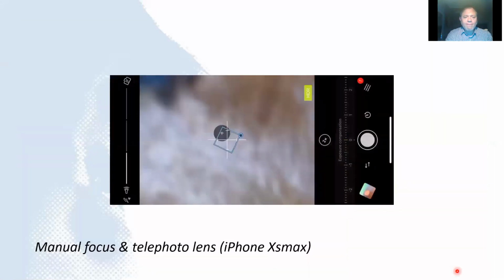A few case examples. This is a horse with active chorioretinitis. Eventually this will turn into an enormous butterfly lesion. And just to show you that we're trying to focus on different parts of the eye: we're focusing on the tapetal fundus in one way, the non-tapetal fundus in another way, the optic nerve in another way. And those pictures together give us the overview of the whole pathology.